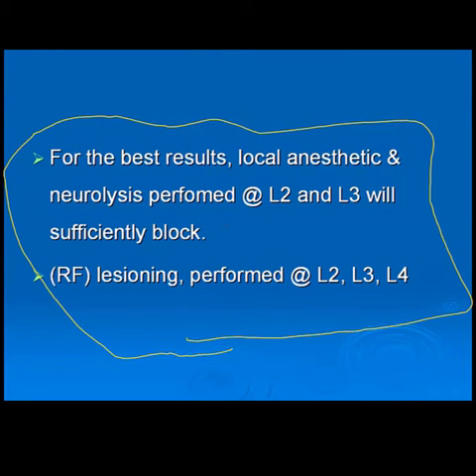For best results, local anesthetic and neurolytic at L2 and L3 will be sufficient to have the block. While if you would like to have good results in doing the radiofrequency lesion, you've got to do it at L2, L3 and L4.